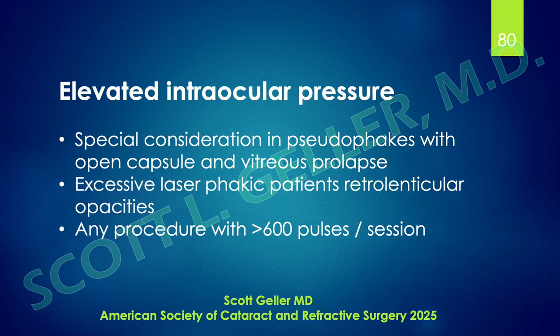Maybe instead of going in with 300 to 500 pulses, you'll go in with 100 pulses. This can occur in any procedure with more than 600 pulses per session. When you get up to that level, you have to be extremely, extremely careful.